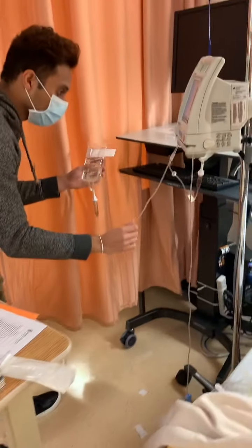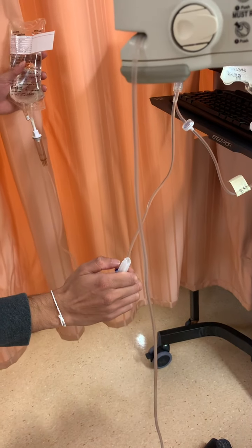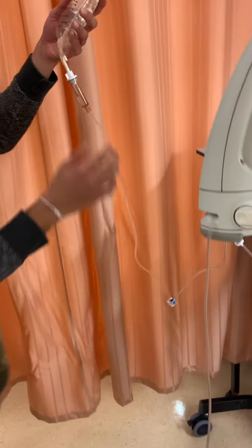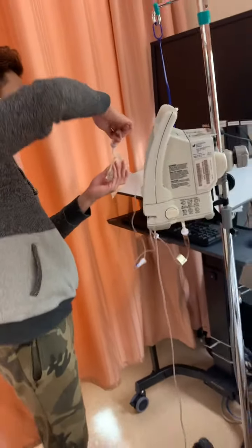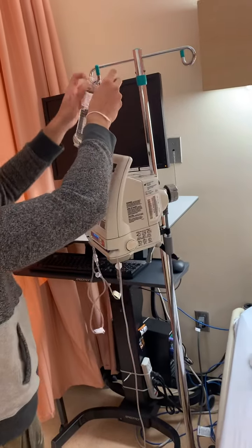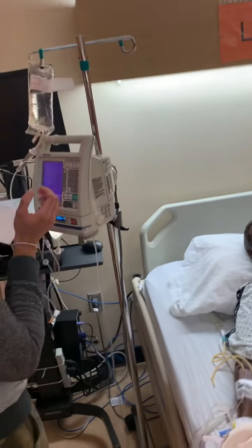So the reason we're back priming is just to get rid of the air bubbles. Okay. So back prime. Okay. And now we got rid of all the air bubbles, so it's all good. And it's about 1/3 full. And we're just gonna push it into the chamber, so it's good. And now we're just going to do our calculations here.